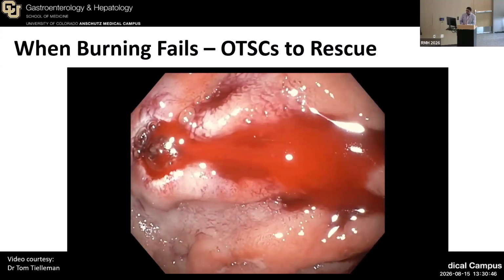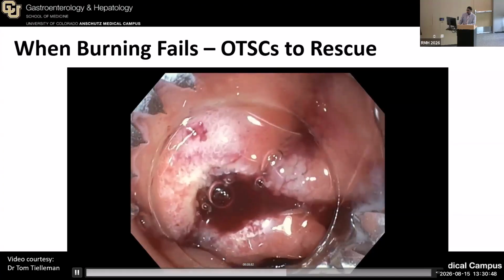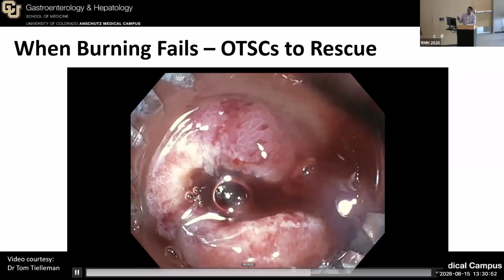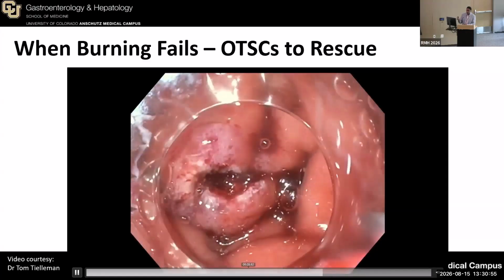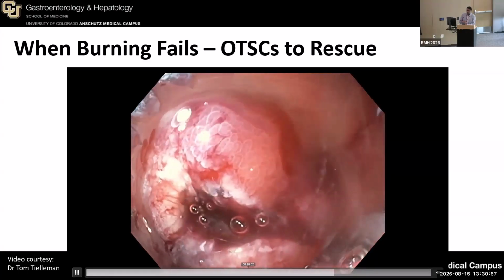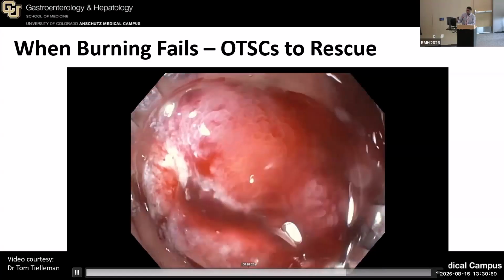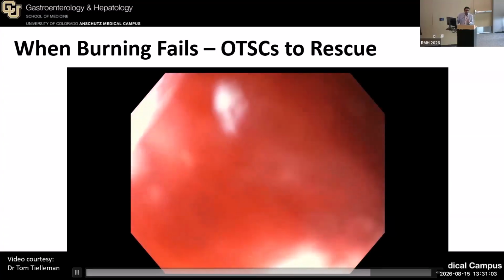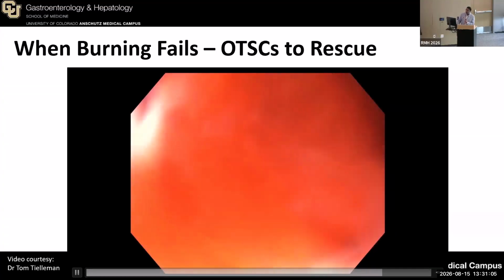So you'll see here that in this case, you put it over the scope. You want to make sure you take your time, and you don't want to do a lot of test suctions because you can make the bleeding worse. So you want to make sure you're fully around the vessel. Take your time, suction. You want to suction really well. And then you want to deploy.